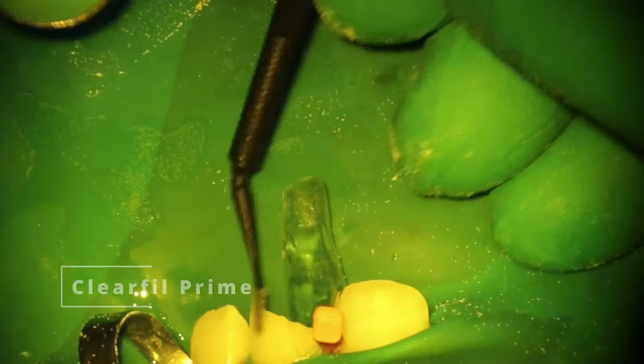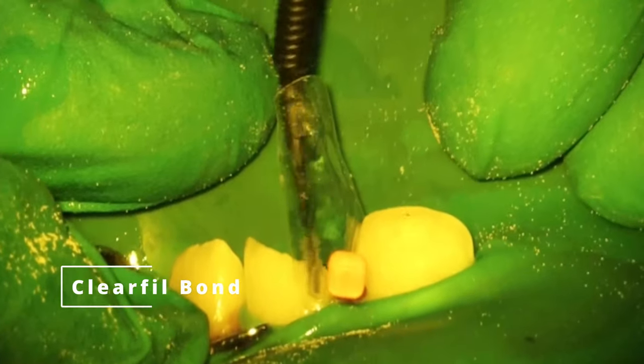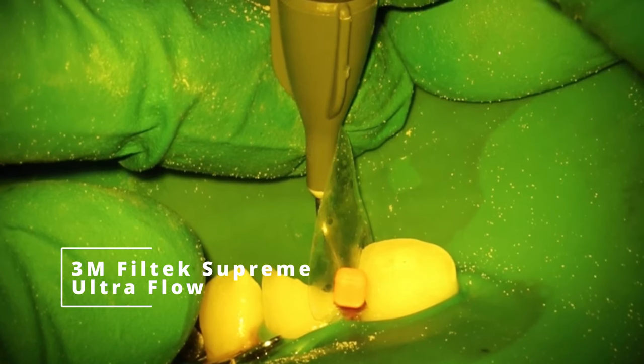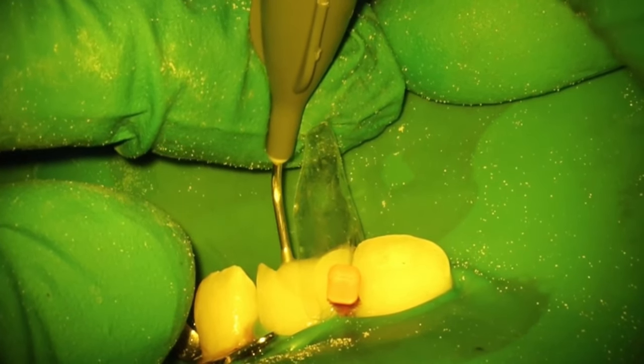Go in here with our primer like we would normally. For the Bioclear system, you want to actually use a little bit of extra. Same thing with the bond. This helps kind of lubricate for the flowable and the packable composite when you injection mold inside here. So this is heated 3M Filtek Supreme Ultra Flow flowable composite. This is shade A1. Going to fill that up kind of roughly the size of it.